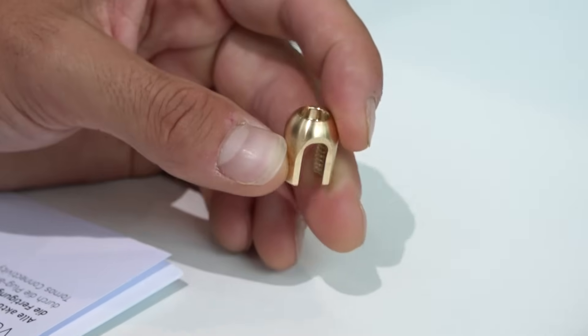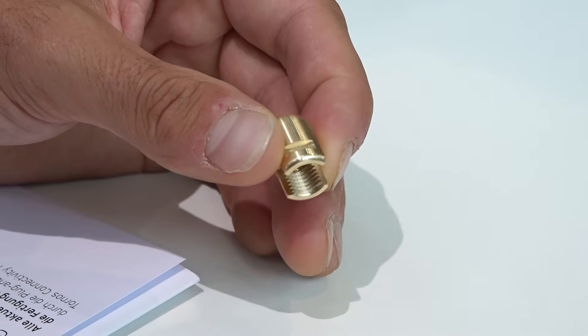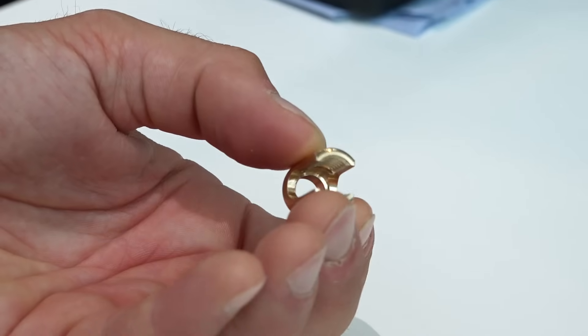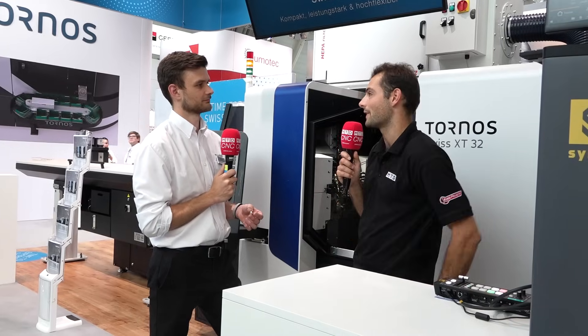On the Tornos stand here, the general theme has been medical components. Tornos machines can be used for lots of different applications, but why medical, and how does this Swiss XT32 machine apply itself so well to a component — a medical component just like this?